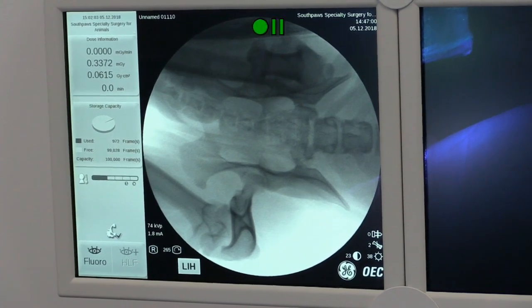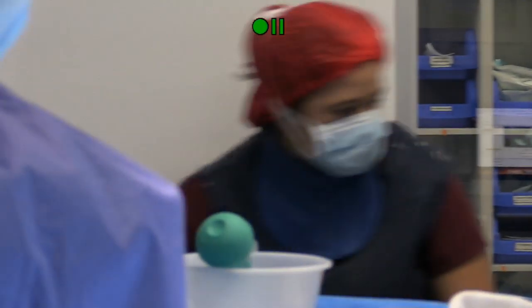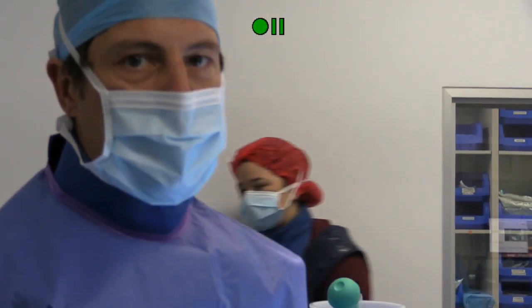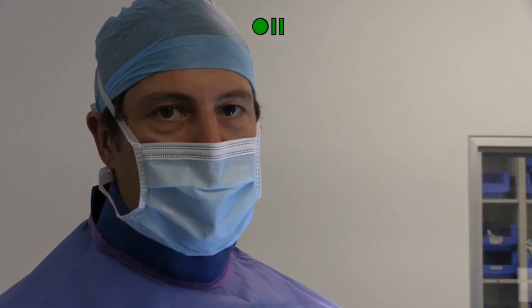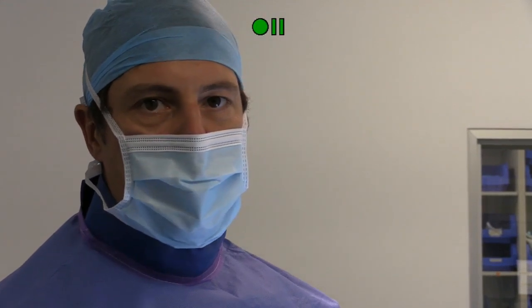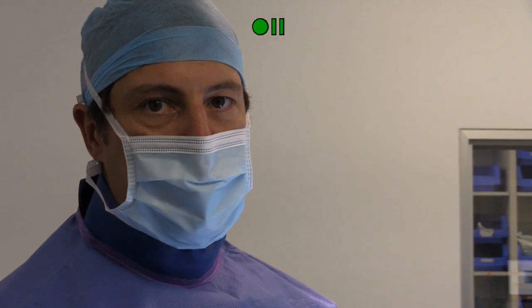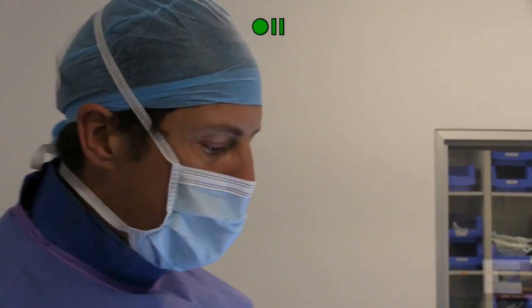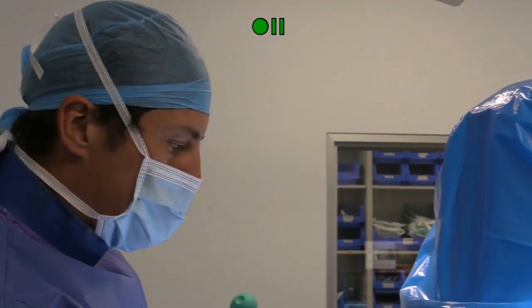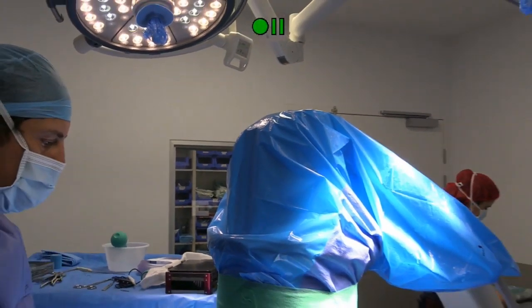So on the CT scan, technically we probably could have got away without doing a CT scan in this case, but we started to perform CT scans routinely on pelvic fractures, because in a few cases I've identified fractures within the pelvis that we weren't expecting just on the plain film x-ray. So now as a matter of course I do the CT scan for pretty much every pelvic fracture, and I really think it helps with the preoperative plan, especially when we're doing something with fluoroscopic guidance. If we can plan as accurately as possible before we walk into the operating room, I think that's optimal.